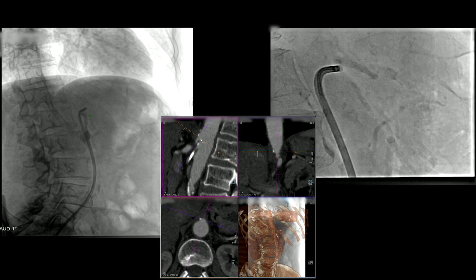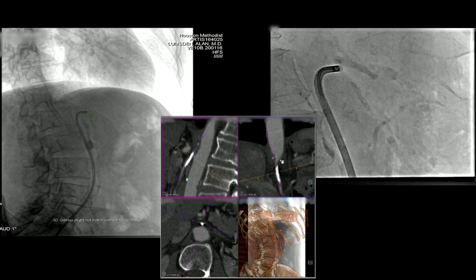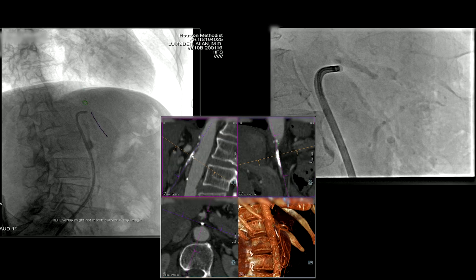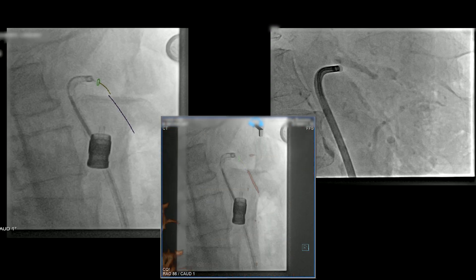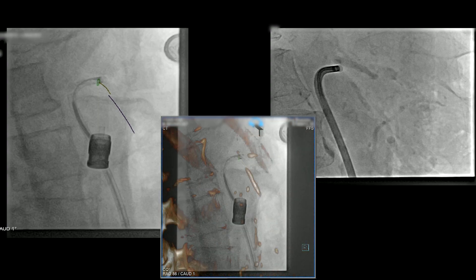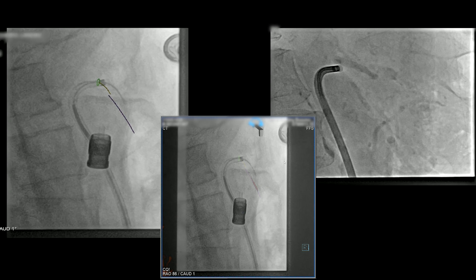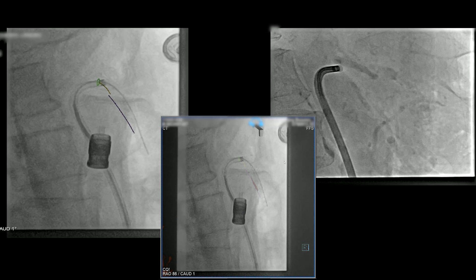You do that by drawing a circle around the orifice and then drawing a centerline which gives you the trajectory of the superior mesenteric artery. If we can get the fusion right, then we can lay the Tour Guide right up against the origin of the superior mesenteric artery. When you insert a wire, it should follow that direction right down it. There's always a little bit of deformity from these devices because the CT scan is done with no devices in there.